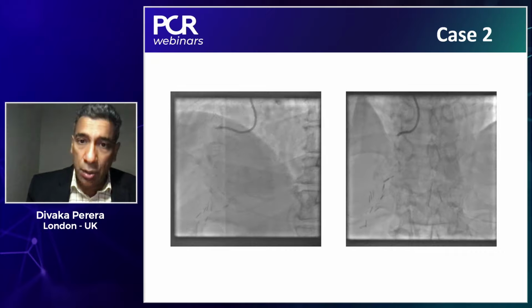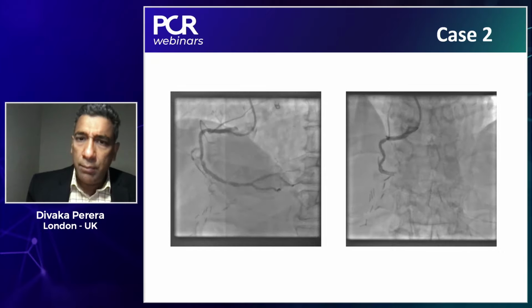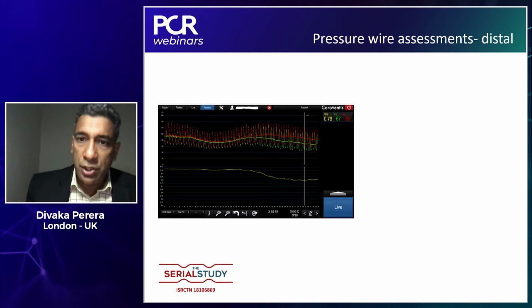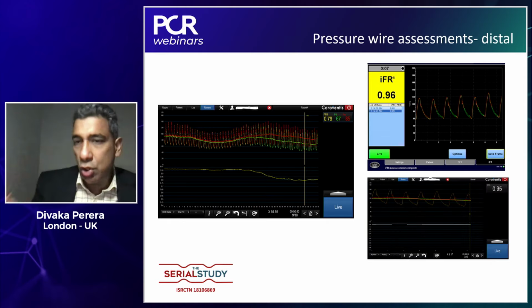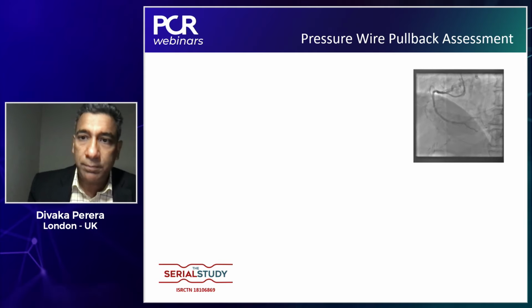Now here's another right coronary artery, a different patient, a focal lesion before the crux and a more diffuse segment of disease proximally by eye. First measure the FFR, 0.79. Now here's something interesting. When we did non-hyperemic ratios, and the top is an iFR and the bottom is an RFR, this lesion, this vessel was shown to be non-significant. No disease detected at all.